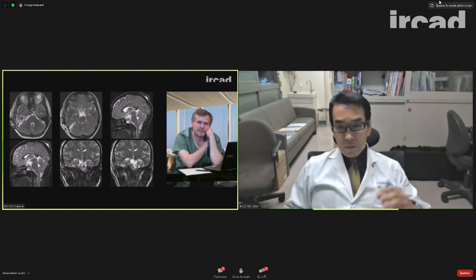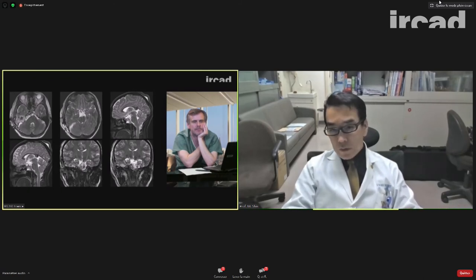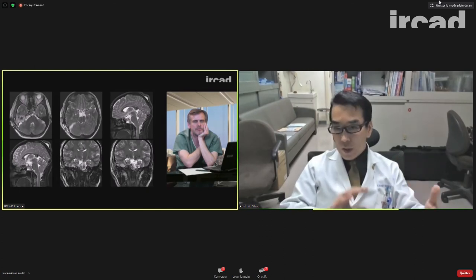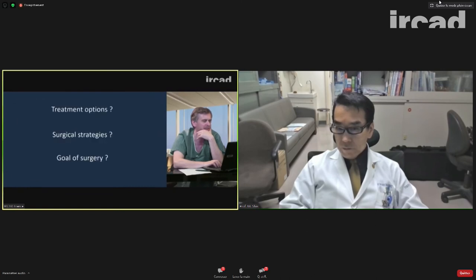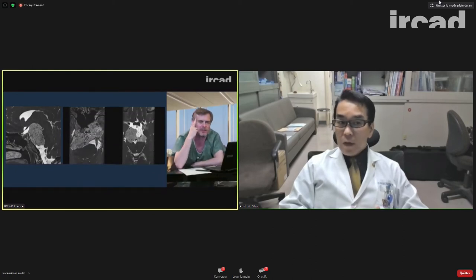But also, I have an impression that when we do the endoscopic transsphenoidal approach, the approach route to the posterior cranial fossa is always a clival recess. So sometimes we don't have enough space. In that case, like this, we have to combine the suprasellar approach, which means we open the tuberculum sellae, and then we go through the clival recess and also the tuberculum sellae, just like the approach to the craniopharyngioma. So in this specific case, if you would have done an endoscopic endonasal approach, you would have also opened the tuberculum sellae to have a superior control of the lesion above and below the pituitary gland, for example.